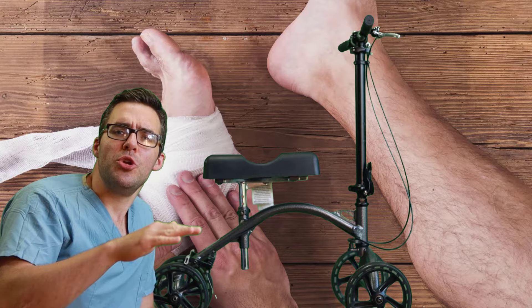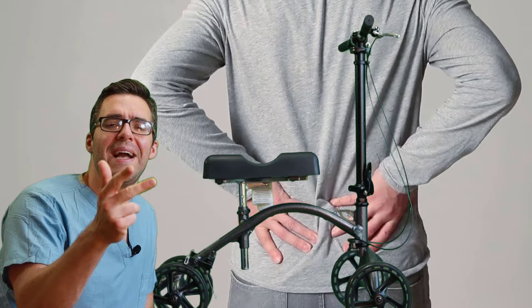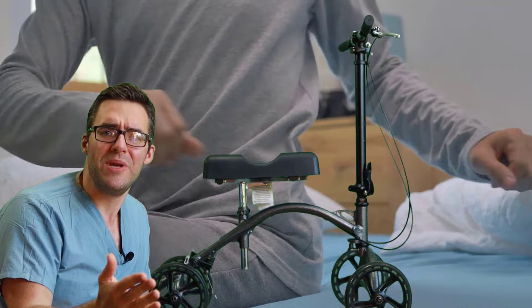You don't want to be bending your back or scooching forward or back. If you're scooching forward or back, you're going to get sore hips, sore legs, sore back, and a sore neck. This stuff is going to hurt you for sure. So make sure you adjust the height of the handles and the height of the seat before you get going.